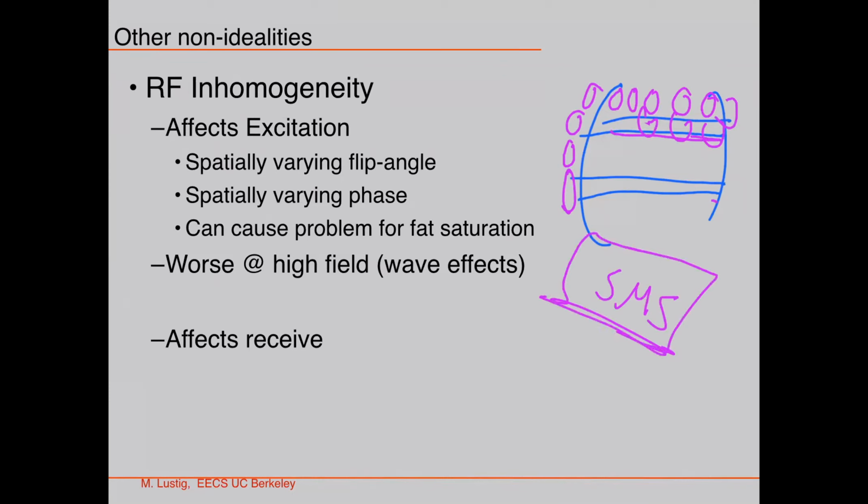It was a big thing 5 years ago. A lot of people started putting that in, and now it's in products and really useful to do EPI, like whole brain multi-slice EPI, sped up significantly using this idea of exciting multiple slices together and then using coil separation in order to speed things up. I'm not talking about that now.